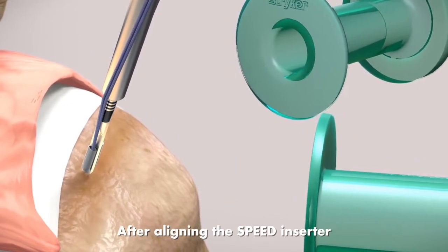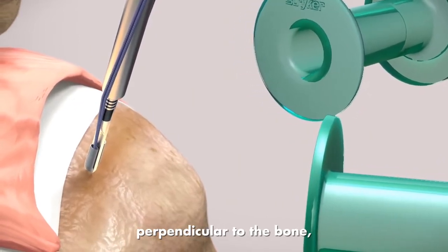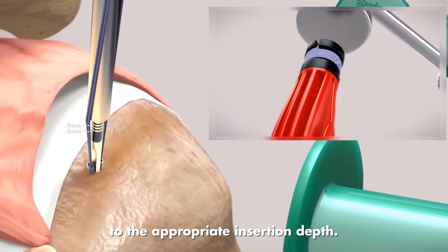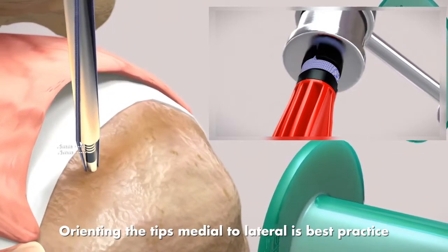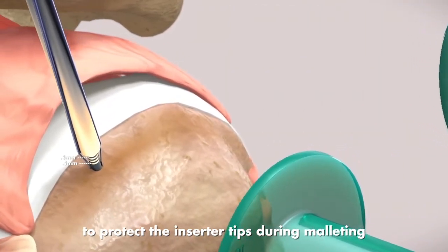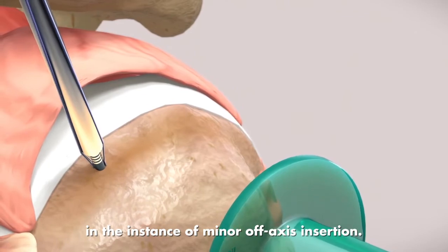After aligning the speed inserter perpendicular to the bone, mallet the speed inserter handle to the appropriate insertion depth. Orienting the tips medial to lateral is best practice to protect the inserter tips during malleting in the instance of minor off-axis insertion.